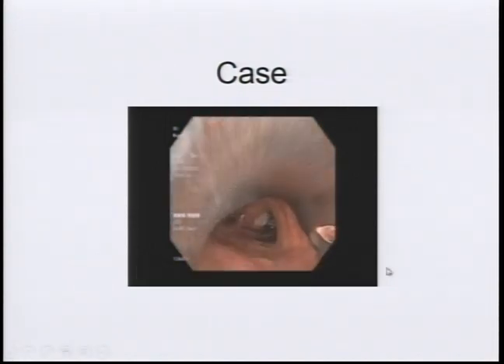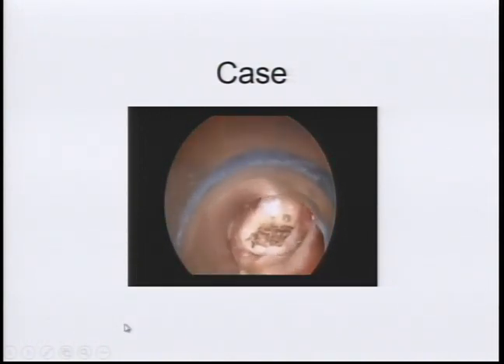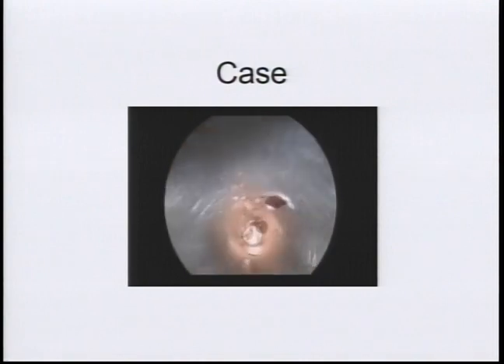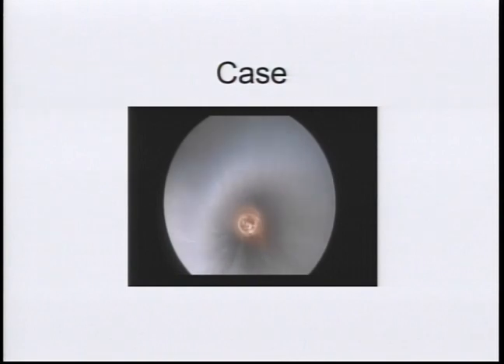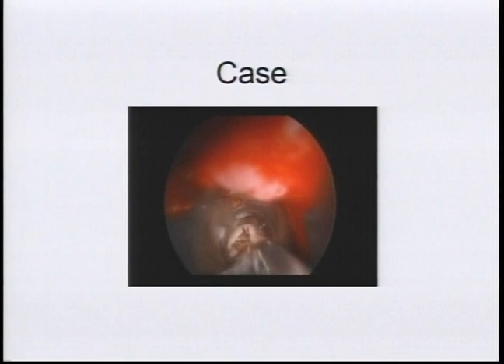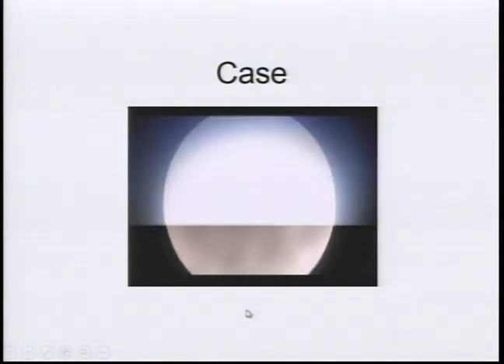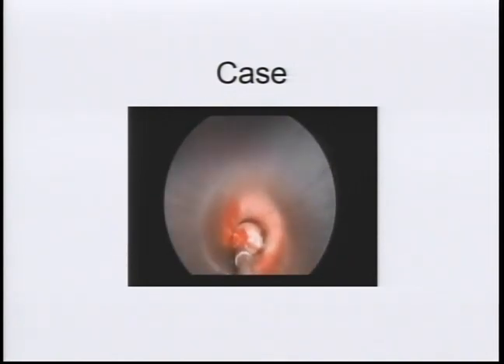So then this is what we just did. After we cauterize the tumor, you can advance the barrel and just core it out. So you just push it in, and it gets in your barrel, and you can grab it and take it out. And there's a bunch of different tools that you can use through a rigid bronchoscope that you can't use through a flexible bronchoscope. So you'll see putting in a grasper. It's a little embarrassing because that's the wrong grasper, and I don't realize it until a little later, so it comes out. And then that's probably the right one. Yeah. So then the tumor comes out.